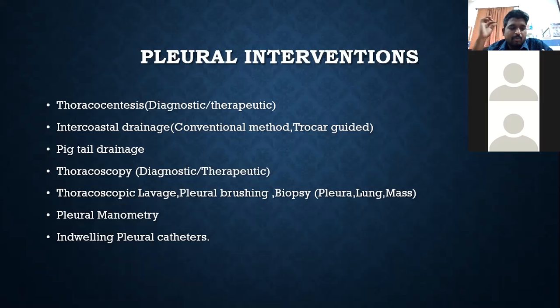You may take a biopsy from the lung piece and get an air leak post procedure, which we don't want. That's why we used to avoid it most of the times. As a pulmonologist, our main concentrating area will be the parietal pleura, not the visceral pleura. So if at all you see any pathology in the visceral pleura and want to take a sample, on the safer side, instead of pinching the pleura along with the lung, you can scratch over it. If you scratch over it, you don't see much damage or much leak over the lung, and it will give a yield also.